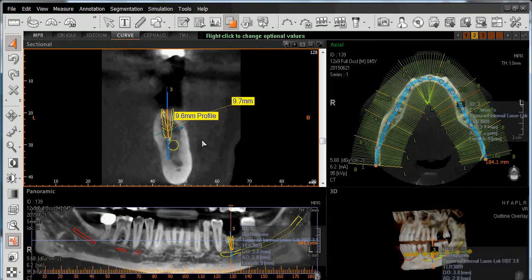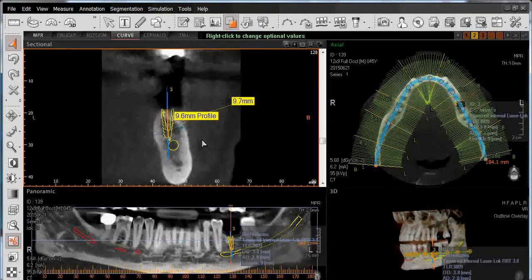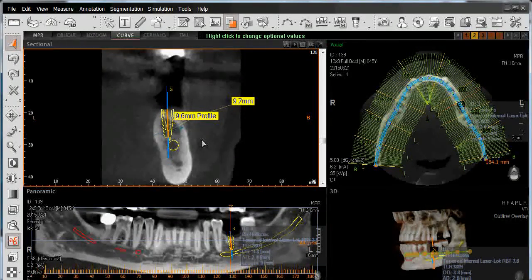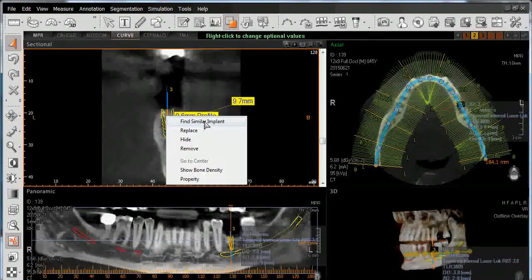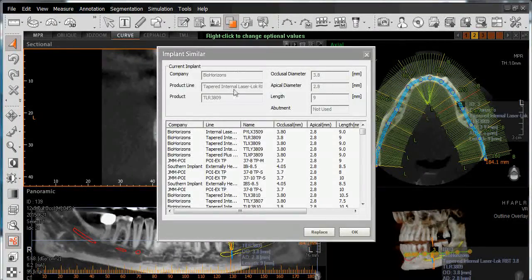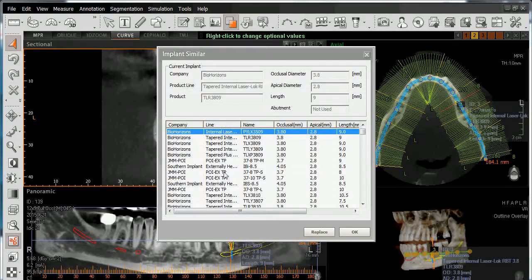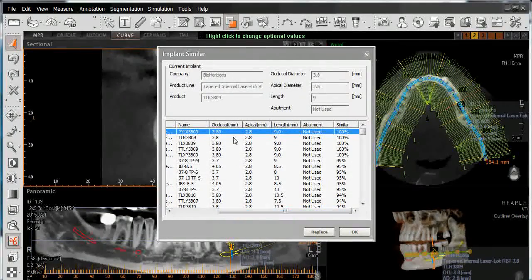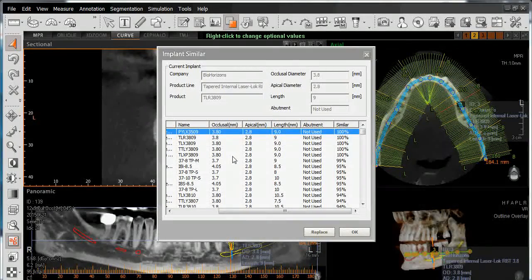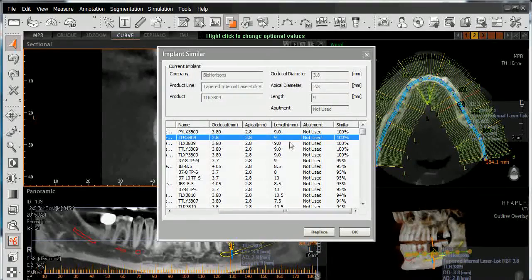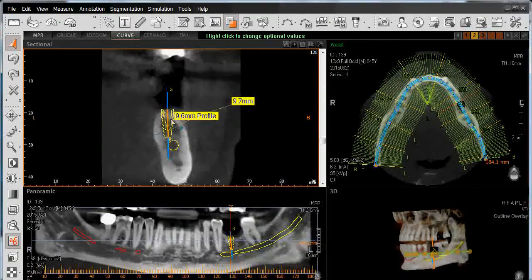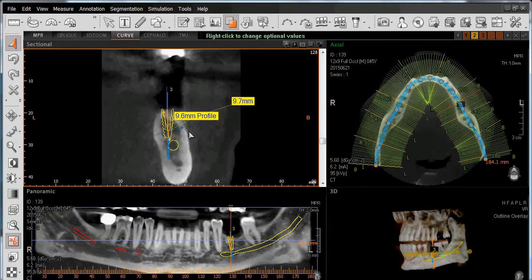Once you've placed your implant, we also have some right-click features. By right-clicking on the implant, we can search for similar implants of the same style by left-clicking on Find Similar Implant. The current implant in place will be displayed at the top of the list. We can then browse available implant systems and choose a similar size based on occlusal, apical, and length, then left-click on Replace.